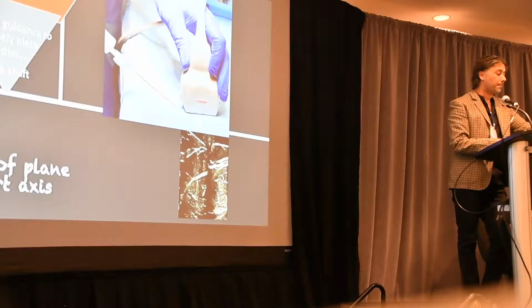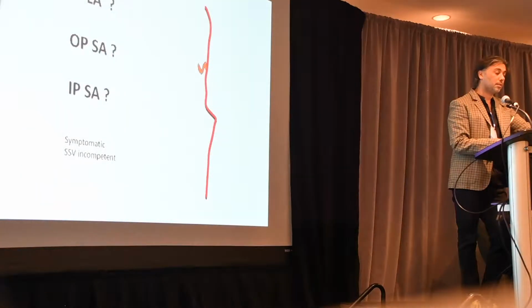this approach. So the in-plane short axis allows an ideal ultrasound image and treatment, with identification of the surrounding structures and real-time guidance at the same time. I would like to report just two cases.